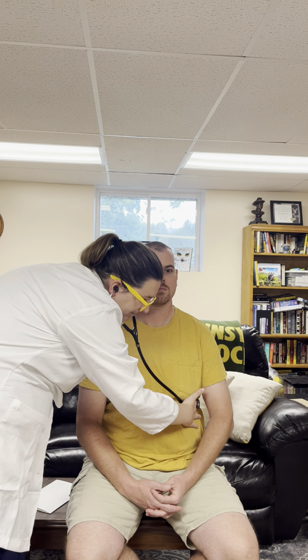Beginning with aortic, just breathe normal. Pulmonic, Erb's point, tricuspid, and mitral.